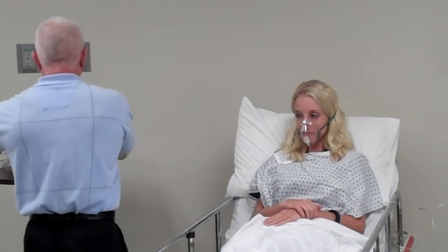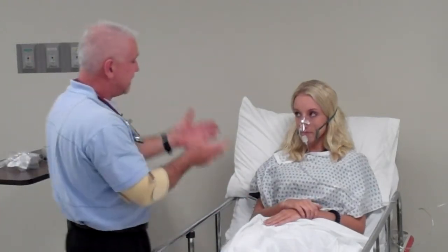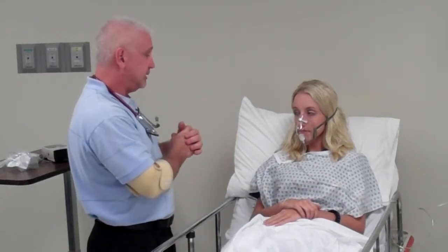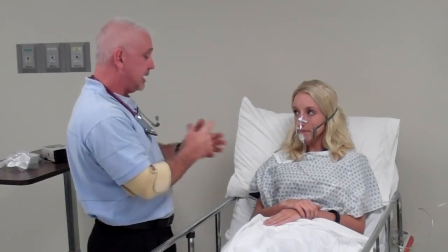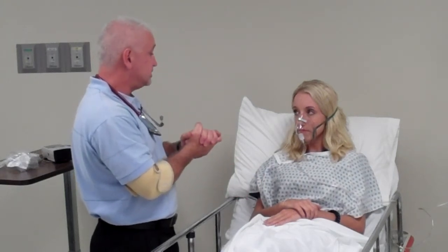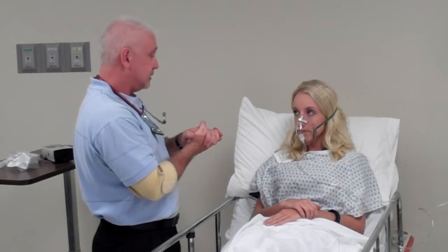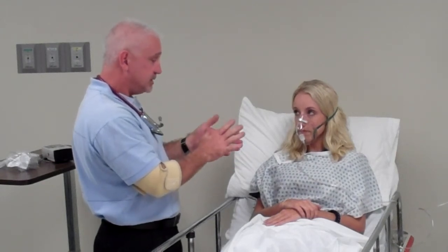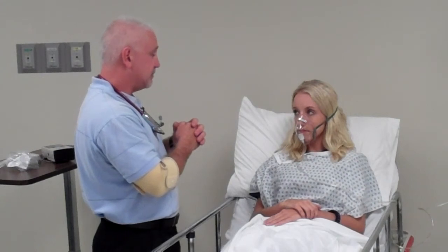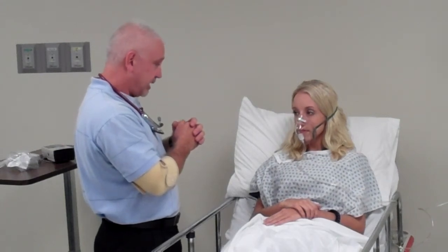At this point, I would tell Ms. Katie, after we reiterate, remind you again: no smoking, no electronic devices, and any kind of hand lotions or gels that you're going to use for your hands or your face, check with nursing first. Okay, if you start feeling lightheaded, dizzy, or nauseous, let the nurse know, and I'll come back and check on you. Do you have any questions for me? No? Okay. Done my reassessment.